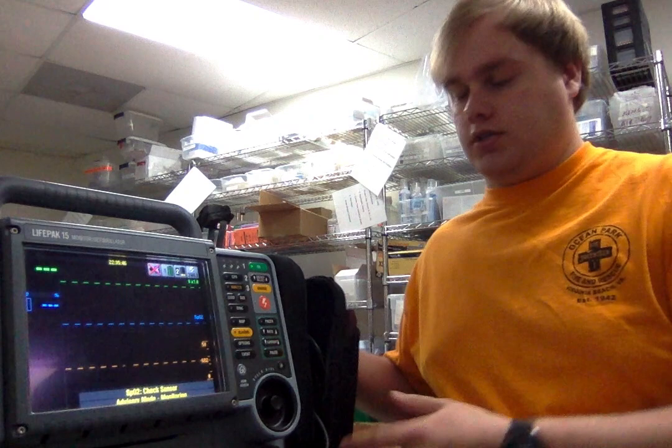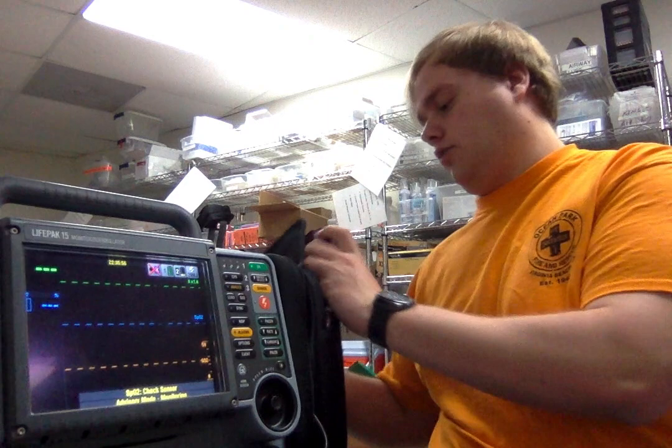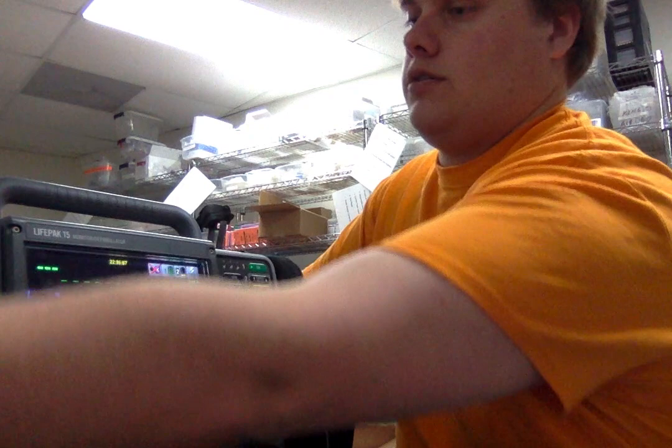It comes with these modules on the side that you're able to store cords in, as well as store items like the pads and the blood pressure cuffs. My agency keeps all of our leads in the top for doing a full 12-lead, which this machine is capable of in this setup.